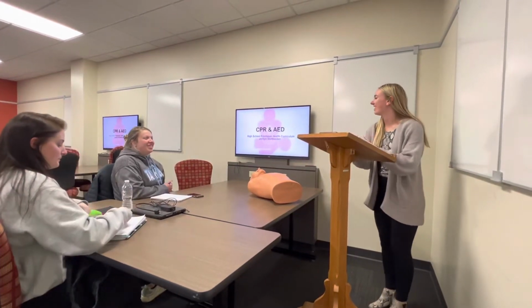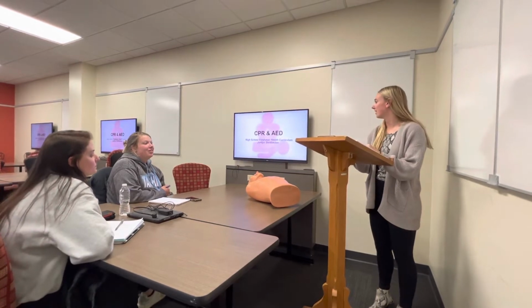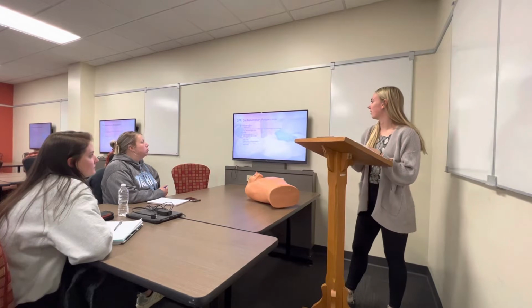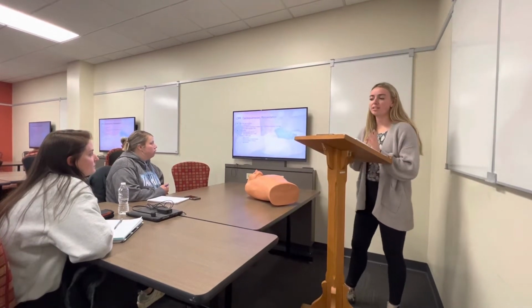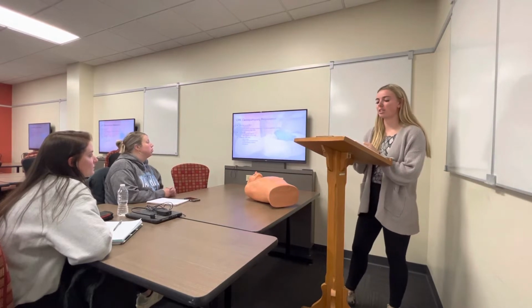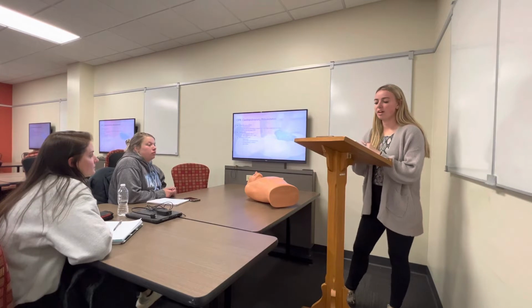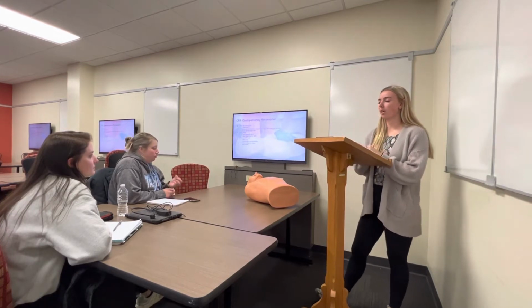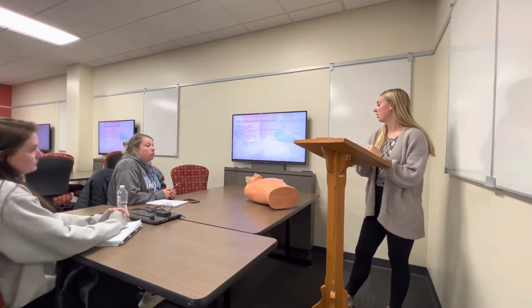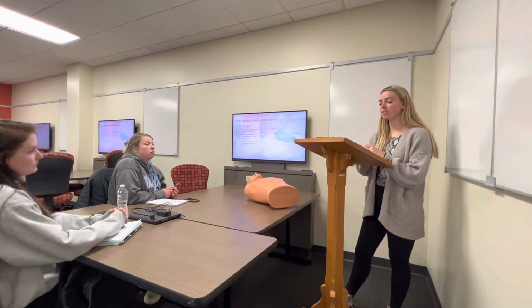All right, hello everyone. Today we're going to be going over CPR and how to use an AED. CPR stands for cardiopulmonary resuscitation. CPR is an emergency procedure that is a combination of chest compressions and artificial ventilation, otherwise known as breaths, used to save a person's life when their heart stops beating or breathing ceases. By doing CPR, you can increase the chance of a person surviving cardiac arrest.